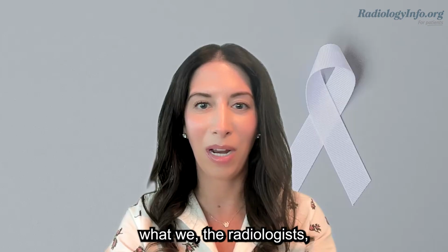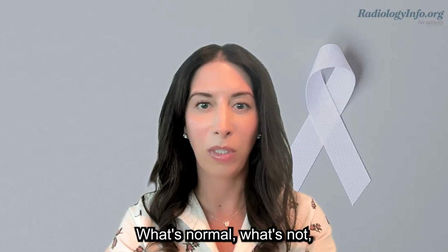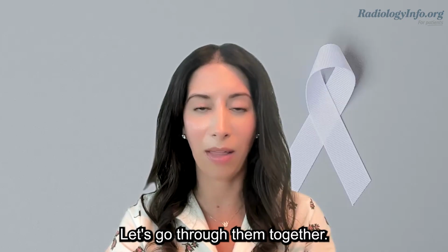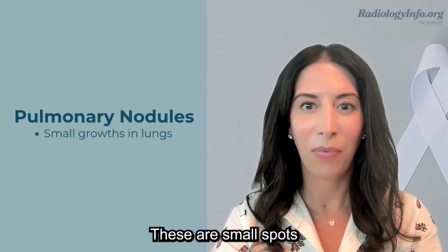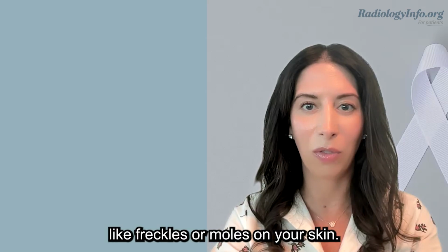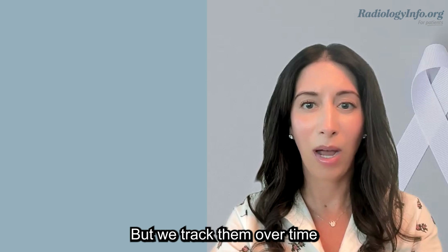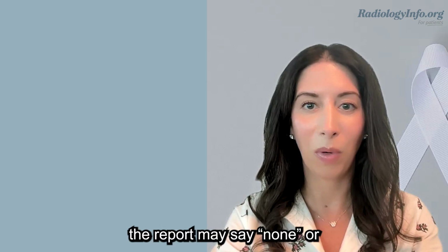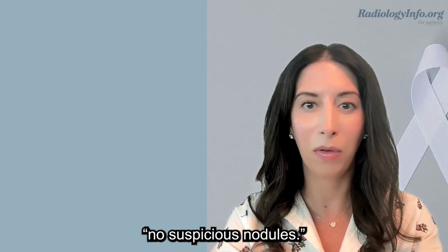Findings. This section covers what we, the radiologists, see on your images: what's normal, what's not, and what might need follow-up. Let's go through them together. Pulmonary nodules. These are small spots in your lungs. Most of them are harmless, like freckles or moles on your skin, but we track them over time just to be safe. If there are no nodules, the report may say none or no suspicious nodules.